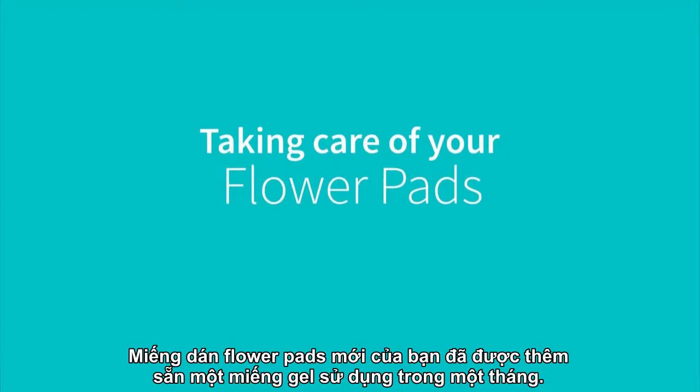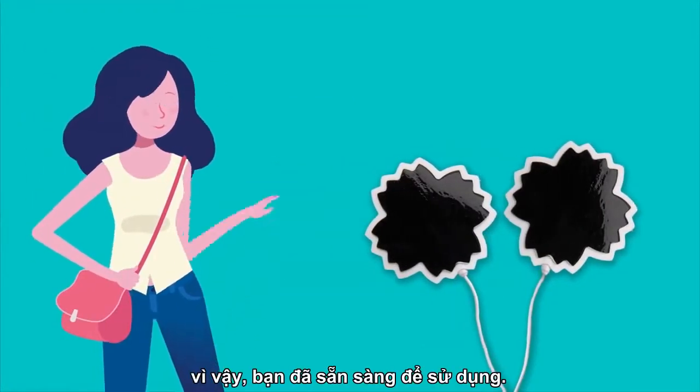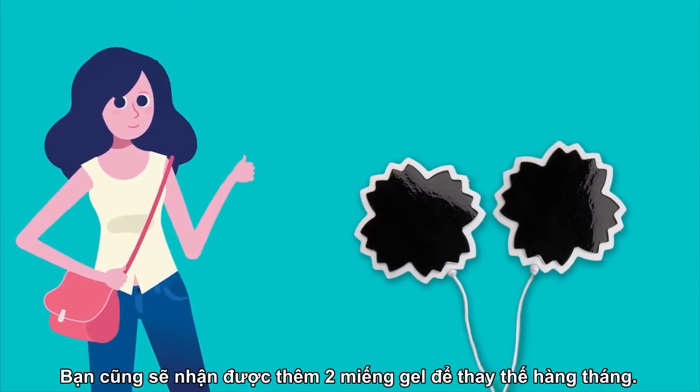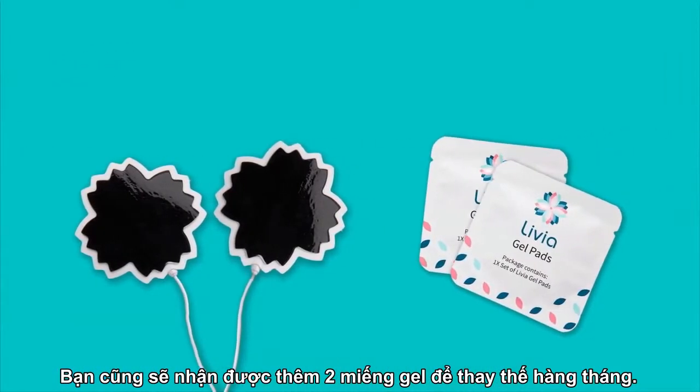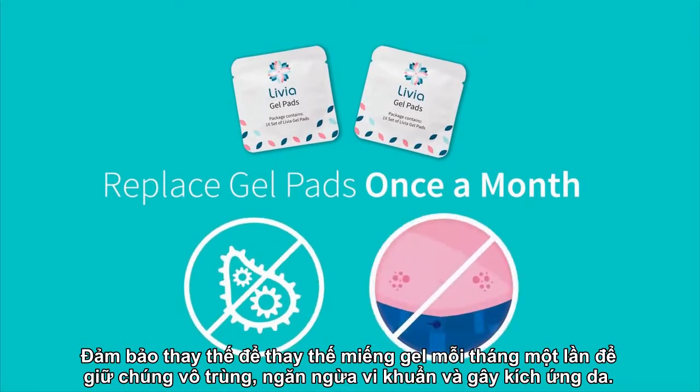Your new Livia's flower pads come already installed with one-month supply gel pads, so you're ready to go! You will also get two additional monthly replacement gel pads. Make sure to replace the gel pads once a month to keep them sterile and prevent bacteria and skin irritation.